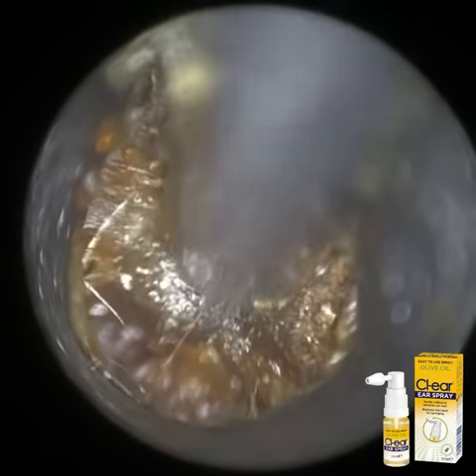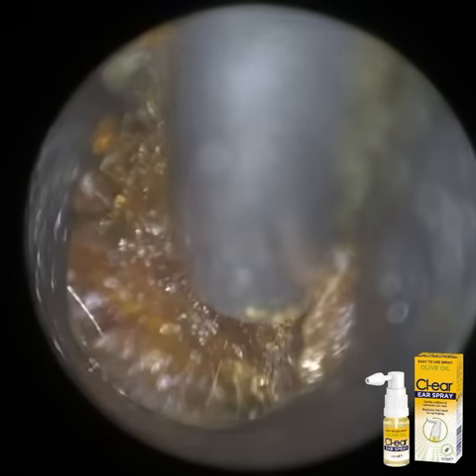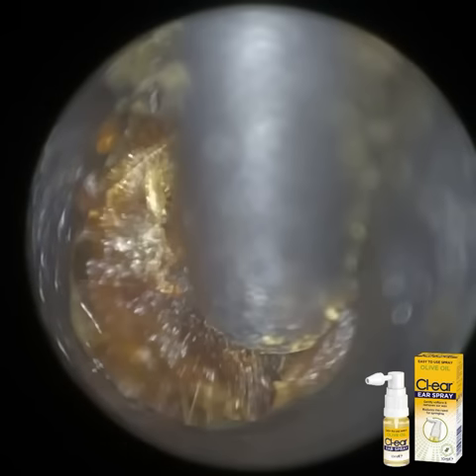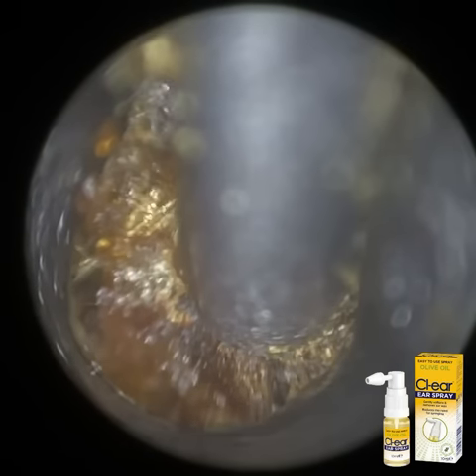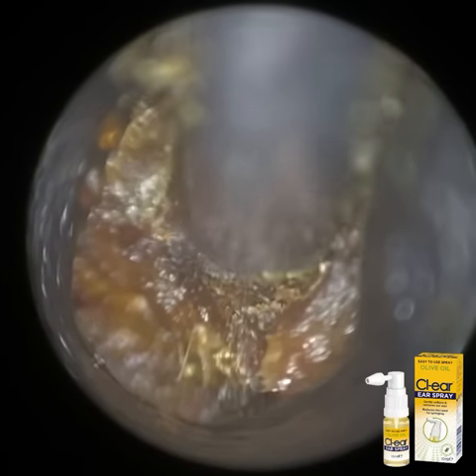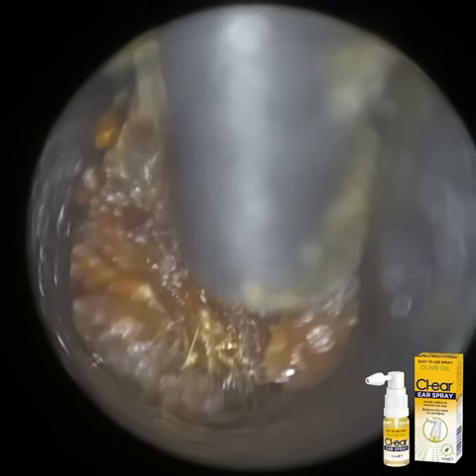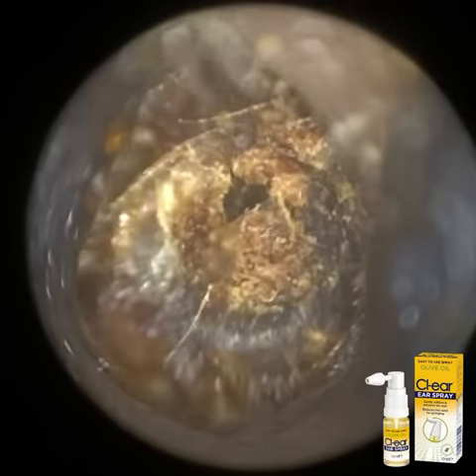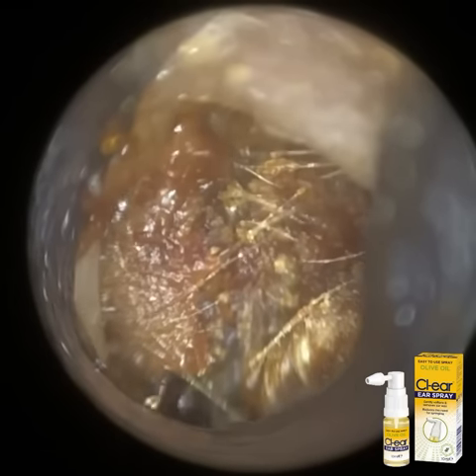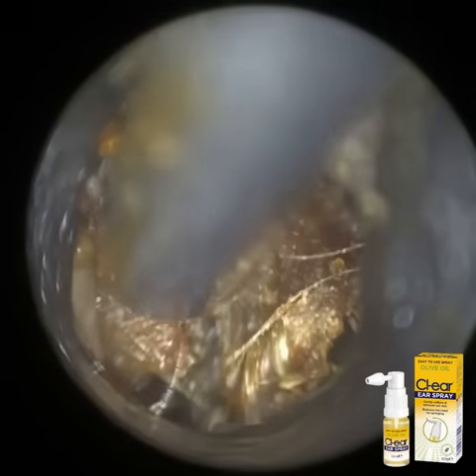And you can see this wax plug is just to the left at 9 o'clock. You may see the second bend of the ear canal, and then the wax plug is beyond that. So it just shows that this patient's ear canal protrudes outwards. It balloons outwards. So as you enter, it's narrow, but once you're in, about a centimetre in, it expands and widens. And because the earwax is located more medially, it's filled up that bigger space, that bigger cavity.